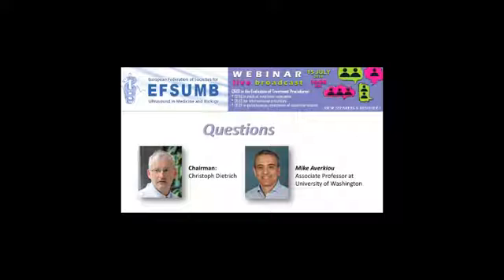Only in the arterial phase. So if we have 2 radiofrequency ablations not in one screen, we have to inject twice. Is that true? Oh, yes, indeed. If we have 2 lesions in 2 different places, 2 different imaging planes, of course we can inject twice. But if somebody is using SonoVue, as we all know, out of a SonoVue vial, we can easily get 4 injections.